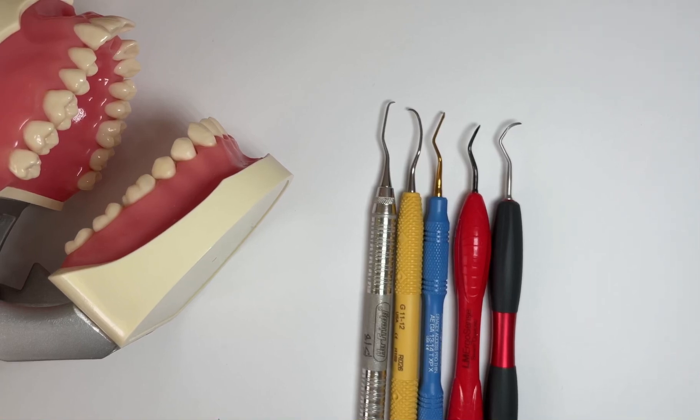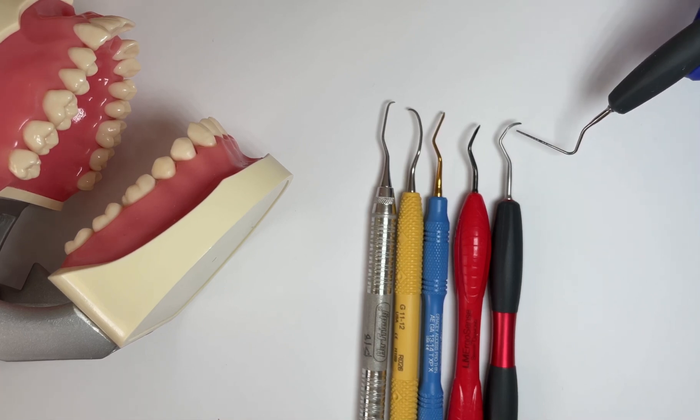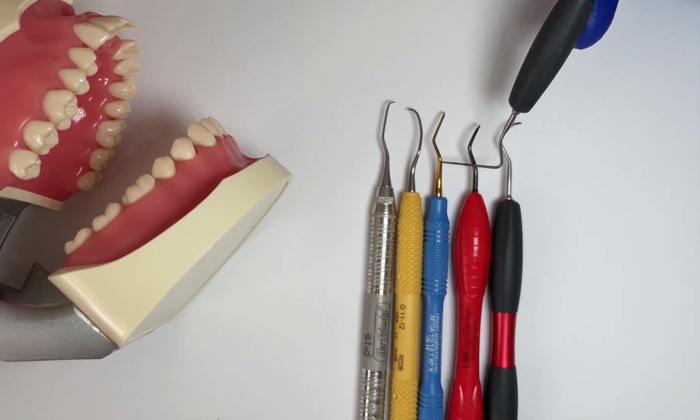Let's talk about the shank of an instrument. From the last bend closest to the handle all the way down to the heel of the working end, this is known as the functional shank of each of these instruments — from here to there on each one.